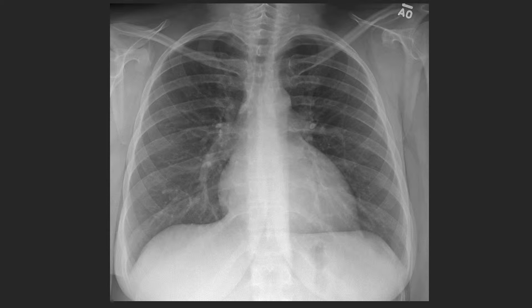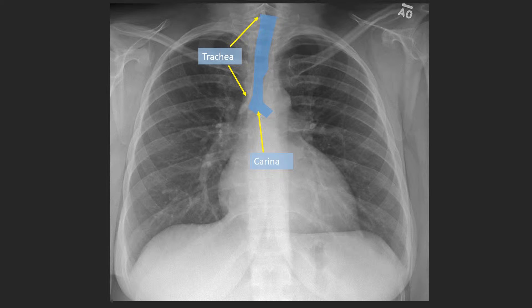This is a normal frontal view of the chest. The airways are air-filled and therefore will appear black. The first structure we have to talk about is the trachea, which is seen here extending from the neck into the mediastinum. The inverted V-shaped portion where the trachea divides into the right and left main stem bronchi is known as the carina, which is seen here.